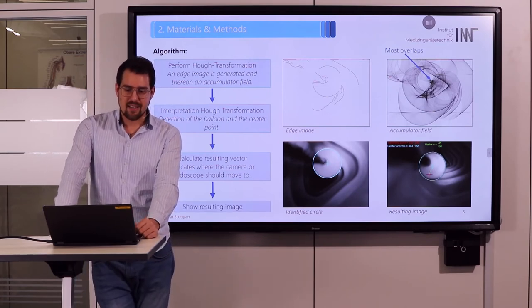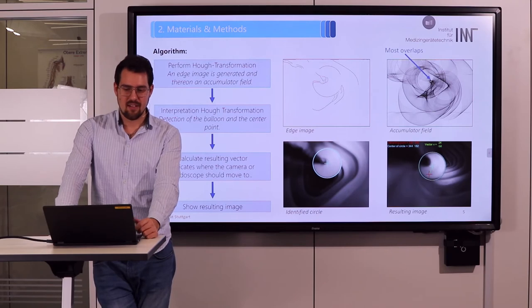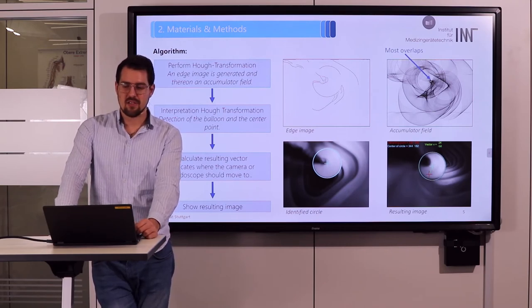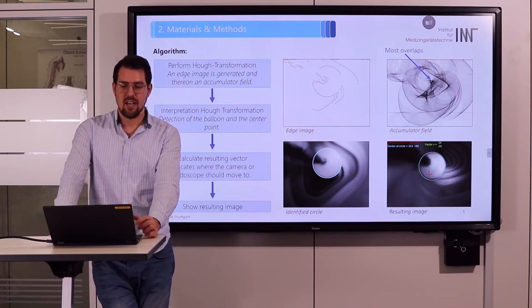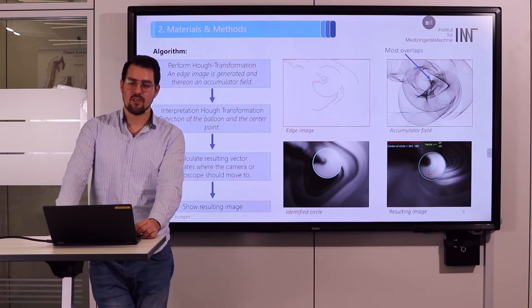To validate the algorithm, 400 images were taken in a colon model. Of great interest for us was the calculation time of the Hough transformation. We used the stopwatch function in MATLAB.